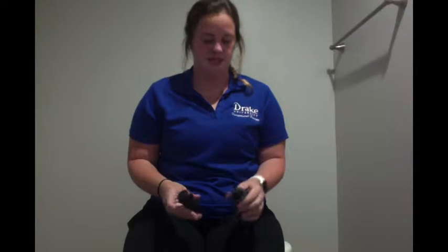Hi, I'm Jessie. I'm an occupational therapy student at Drake University and I am going to show you how to use a button hook.